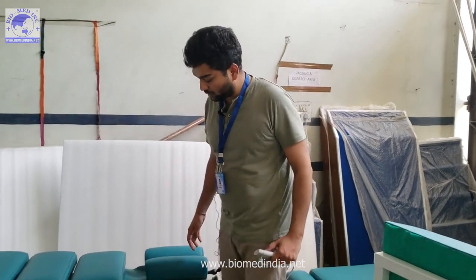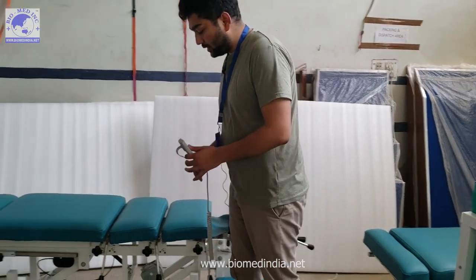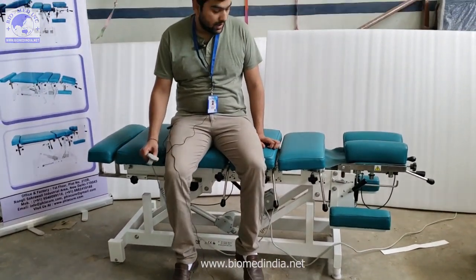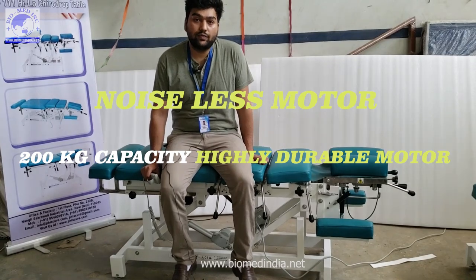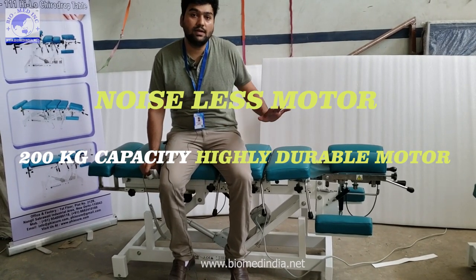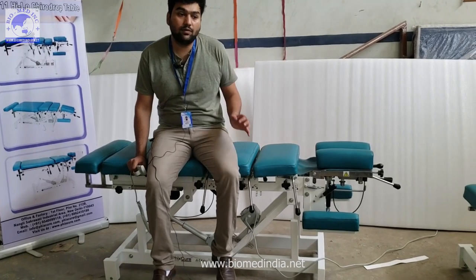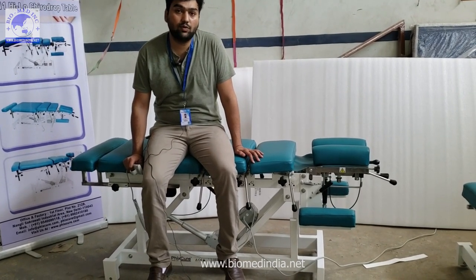The first feature we're going to talk about is the durability of the Hi-Lo motor. We are using an imported motor that can support up to 200 kg of weight. It is a completely noiseless brush motor — the patient or therapist won't hear a single sound from the motor.